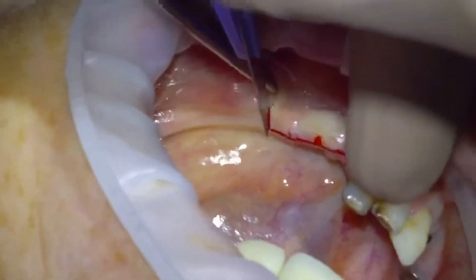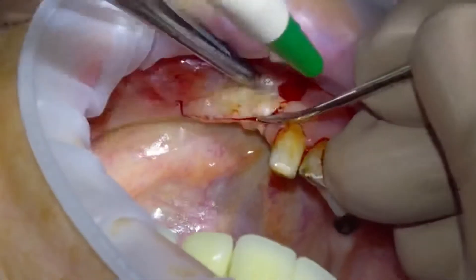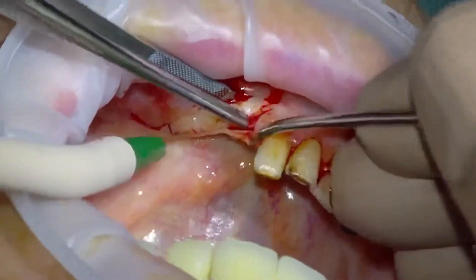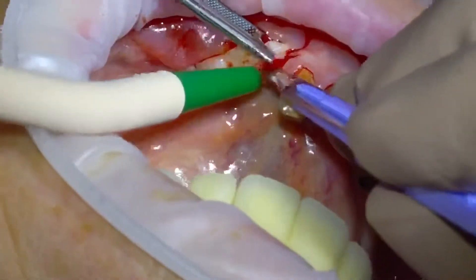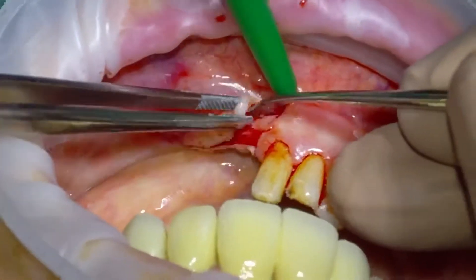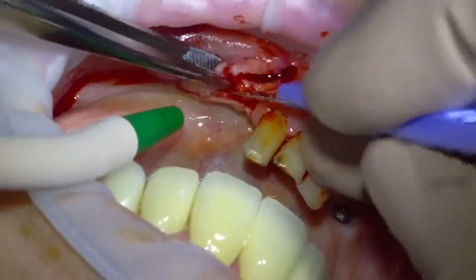Here I'm just doing a vertical relieving incision mesially, and this is to avoid the fibers of the mental foramen which supply the lower lip — so preventing any lip paresthesia, or trying to minimize that risk. Then once we've made our incisions we just raise the periosteum and mucosa and do a little blunt dissection with the tip of the blade to raise the periosteum cleanly.